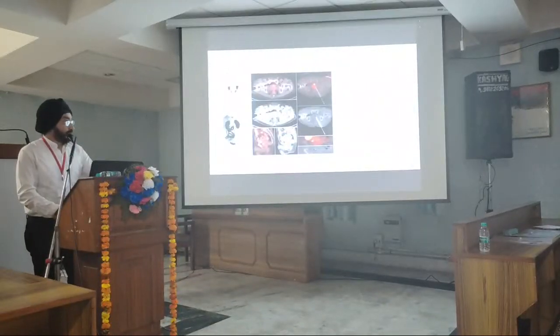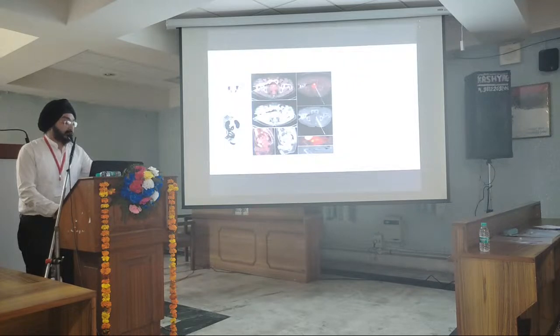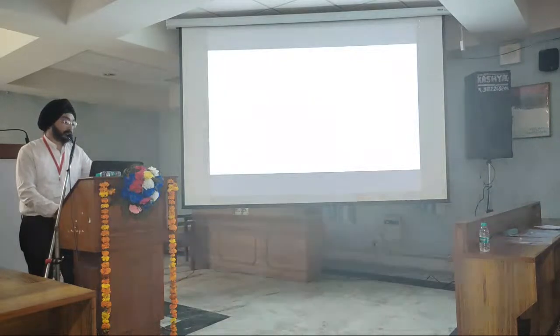And this is one new type of prostate biopsy which has been innovated in PGIMER. So basically we are targeting the prostate cancer in cases with negative transrectal biopsy and high suspicion using a transgluteal approach, which has been published and proven to be very safe, with no risk of infection.